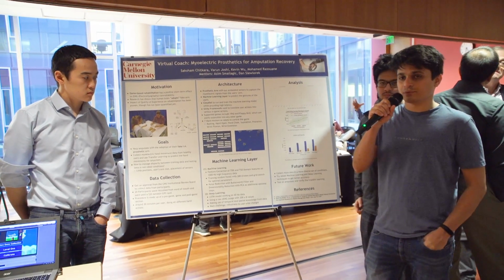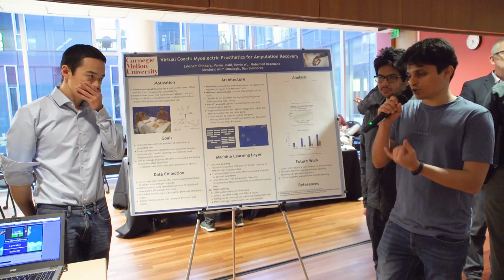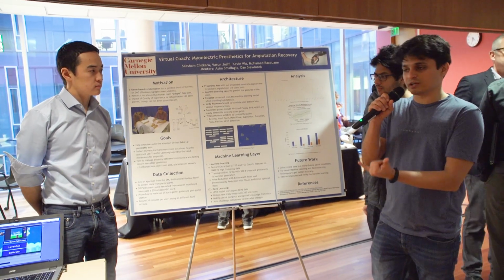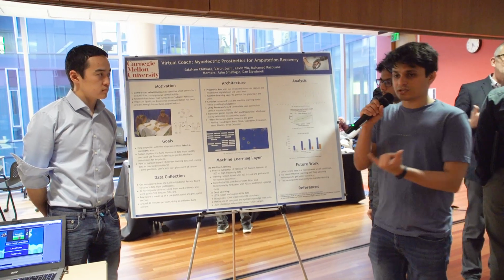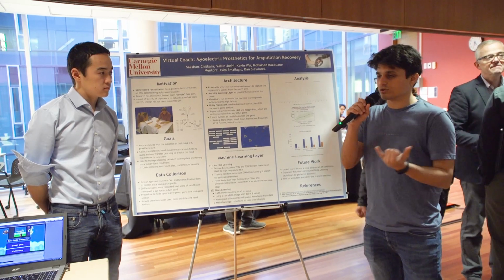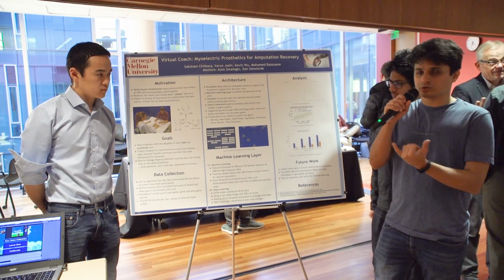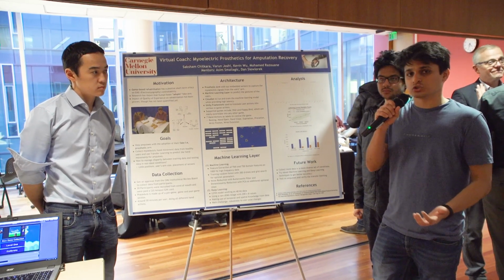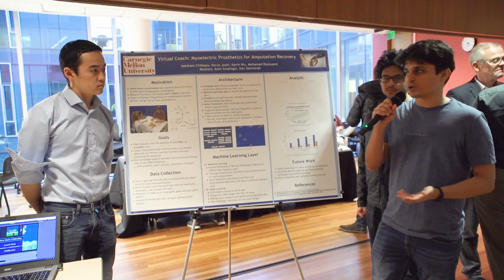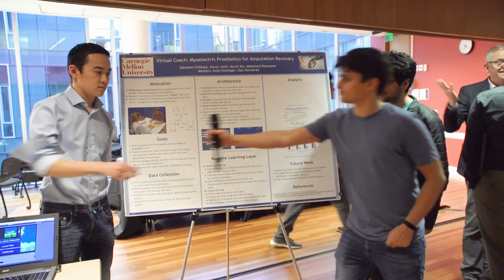We also tried deep learning models, which we trained on SEMG features, which are basically channel frequencies concatenated together across time. We trained an LSTM model on these features in order to capture the temporal, sequential nature of the data. We also use this model in order to be robust to user-wise changes in channel activations. So I'll hand it over to Kevin to talk a little more about the analysis part.